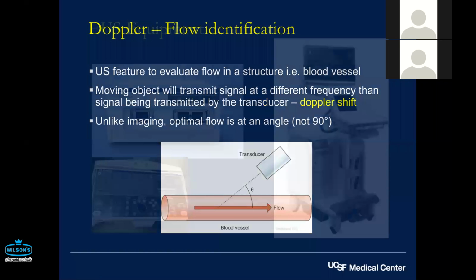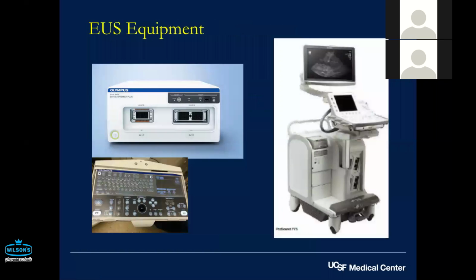So those are the four basic concepts we need to understand: how ultrasound works. I didn't go too much into the details of artifacts and attenuation. All those concepts are available to understand in deeper detail, but the principles need to be understood about how ultrasound signals are generated, what the purpose of the gain and the brightness is, the frequency and what the relevance of that is, and then Doppler flow. And some of these things I'll overlap. So you can have different types of machines nowadays.